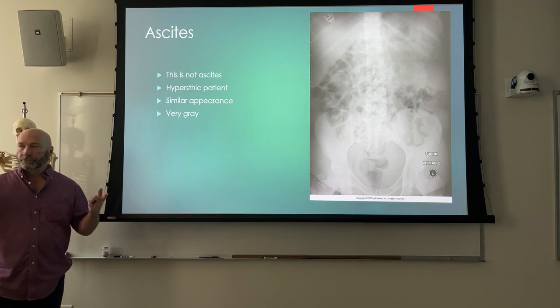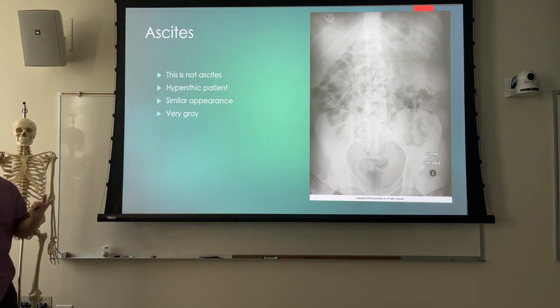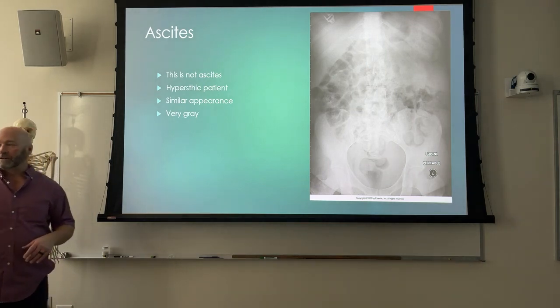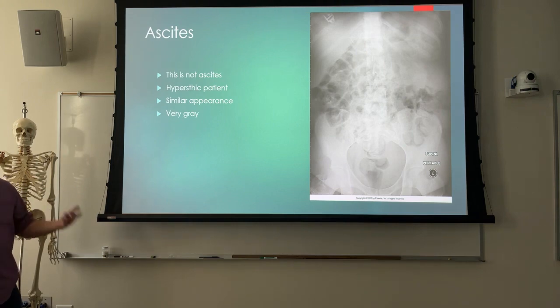And two of those, your technique can kind of parallel each other, but if you're looking at a patient with a big distended stomach and you think the patient's got ascites, and you set a technique for that, and it turns out that patient has bowel obstruction, then you're going to overexpose the patient, overexpose the image receptor, right? So you need to find out what's going on with the patient, or telltale signs of what that is.